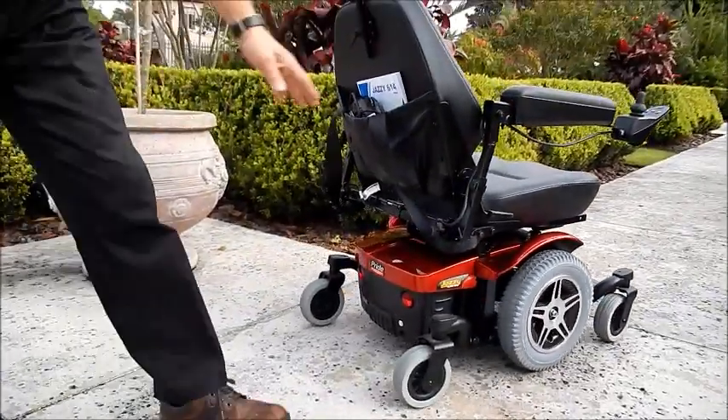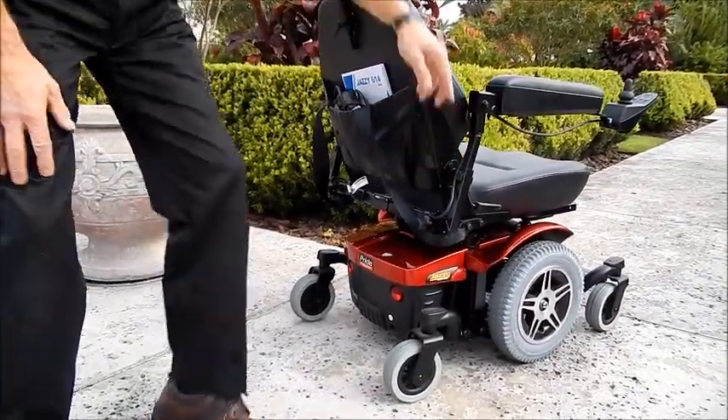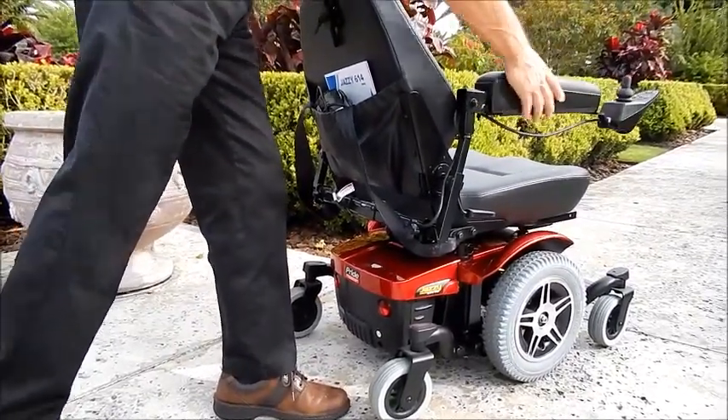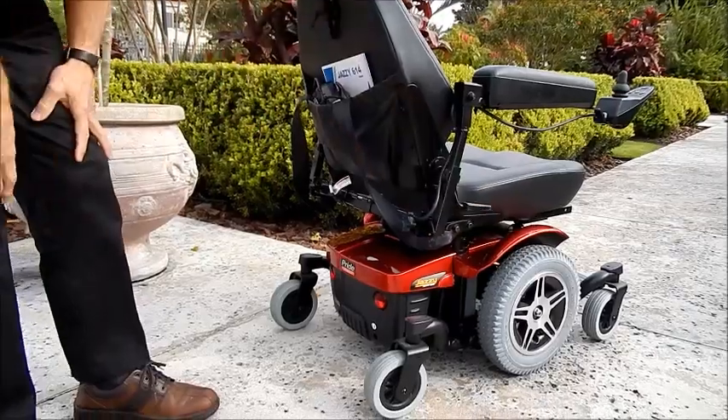This chair also has adjustable arms. They can be adjusted up and down. They can also be flipped up to get in and out, and they can be adjusted out if you need more width.